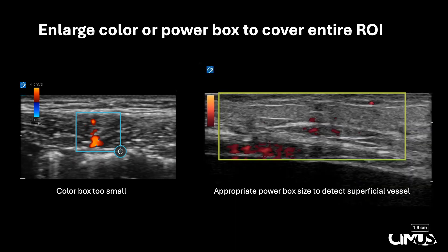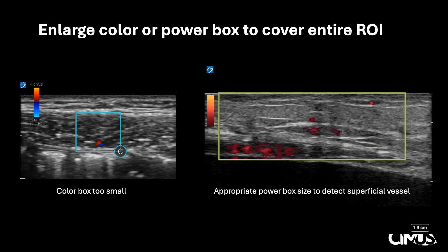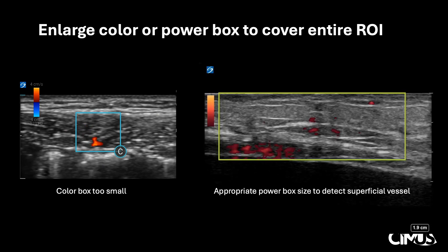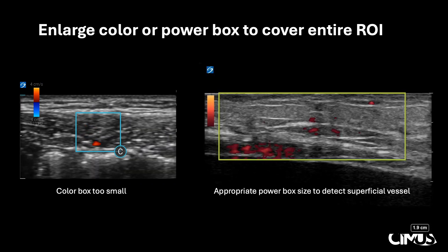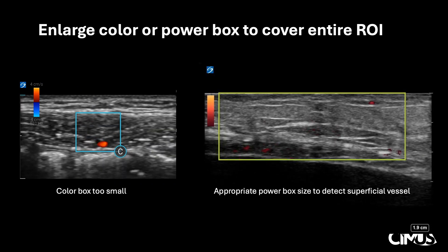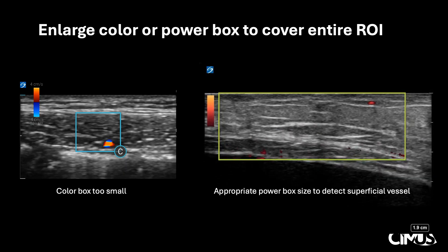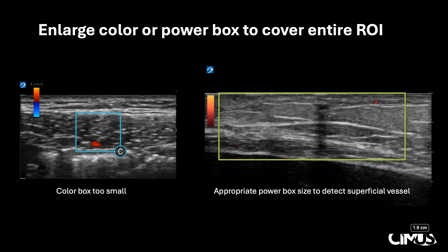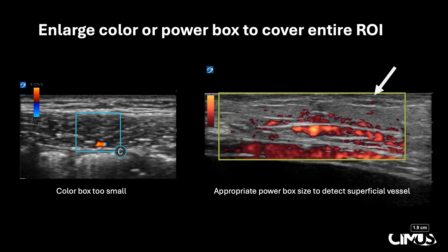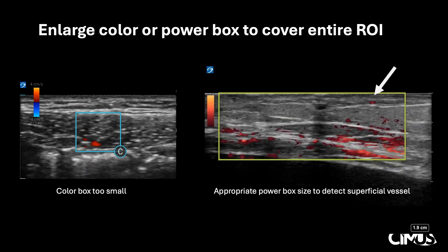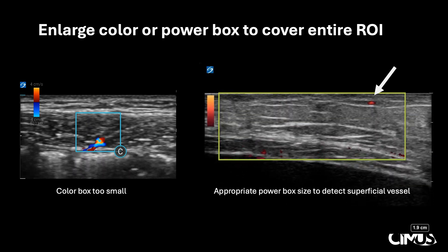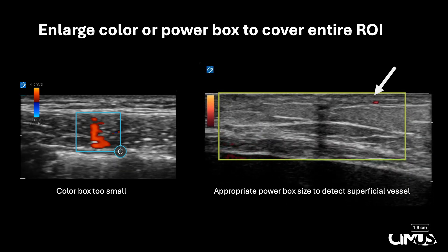Next, failure to adjust the color box can result in missed blood vessels. On the left, we see a color box that is too small. While it has picked up a vessel signal, it is only evaluating a small area of the tissue, with potential vessels in the superficial subcutaneous tissue or in the muscle lateral to the box that would be missed. The video on the right illustrates this point, with a small superficial vessel at the top right of the screen that is only seen as the box is covering all of the superficial structures. It is therefore important to enlarge the color or power box to cover the entire region of interest to avoid missing vessels.